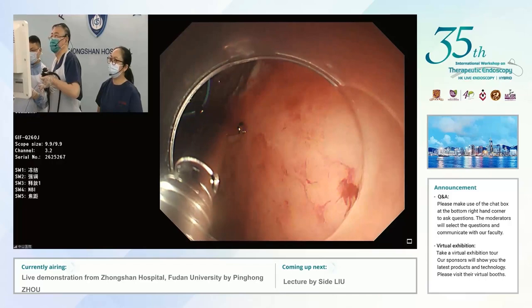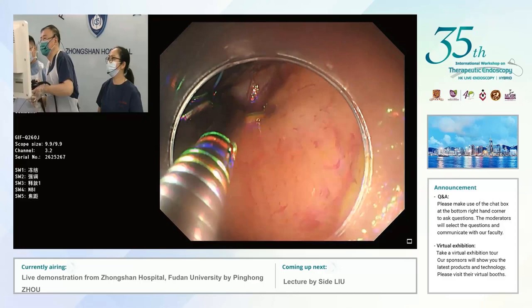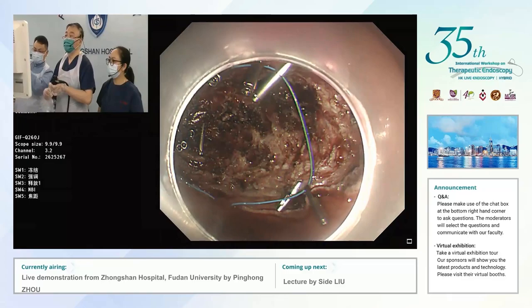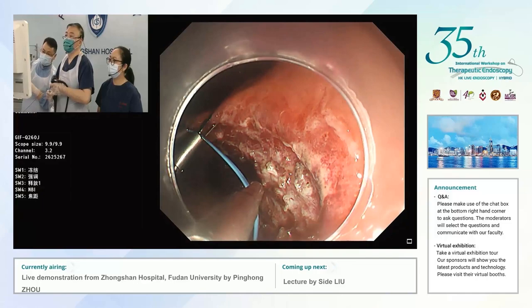The loop was looking too small, but anyway we can shrink the wound and then apply another one. In Shanghai, China, we don't have the over-stitch.